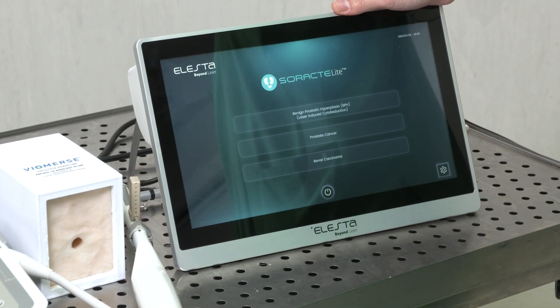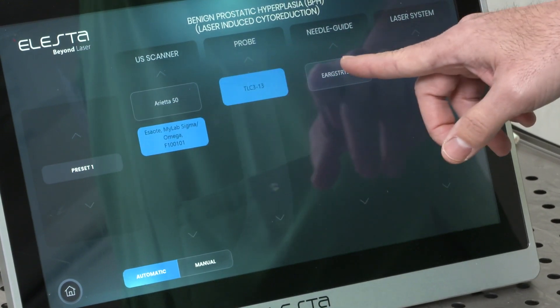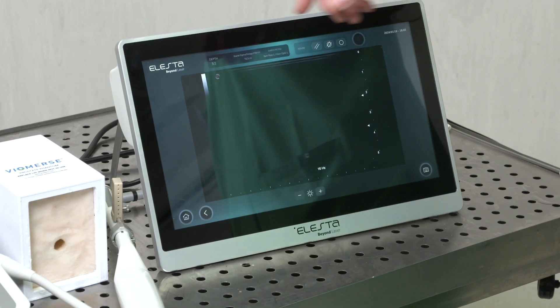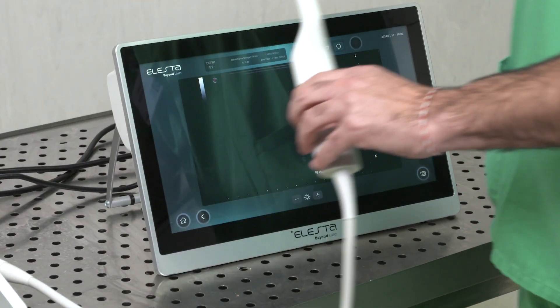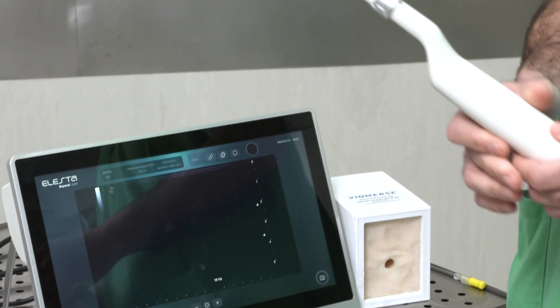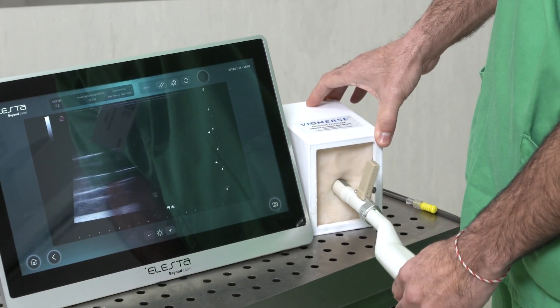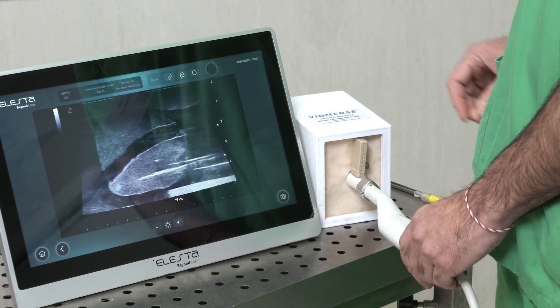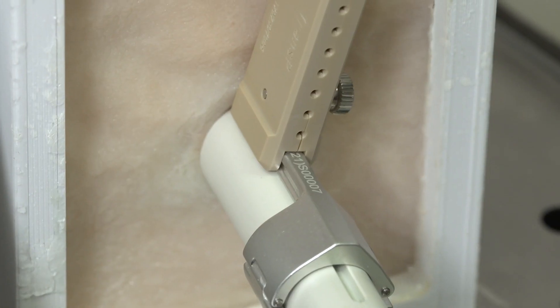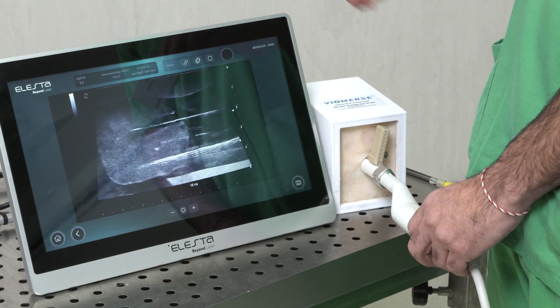To treat BPH patients, we press this button. We select our own ultrasound. We use this transrectal probe — we introduce it — and we can see this needle guide that is very useful to help us in selecting what needle we need to treat the prostatic tissue.